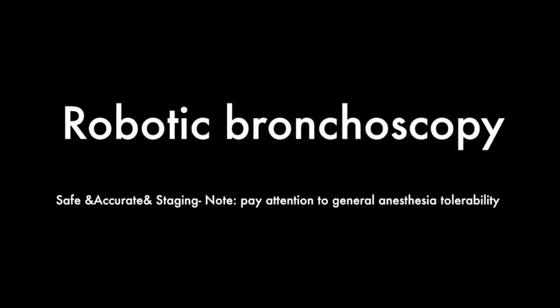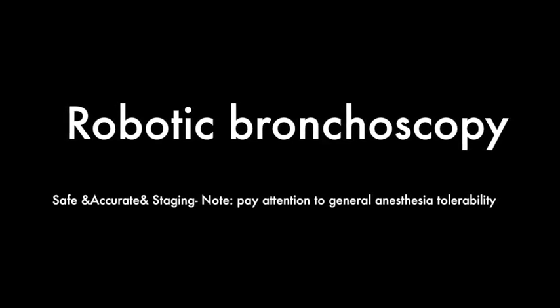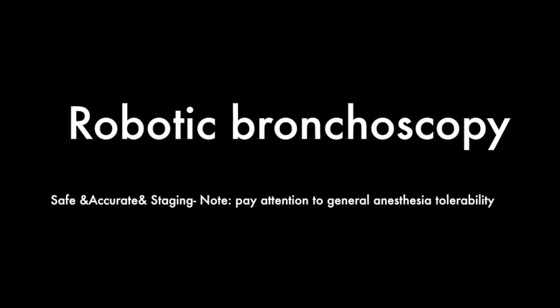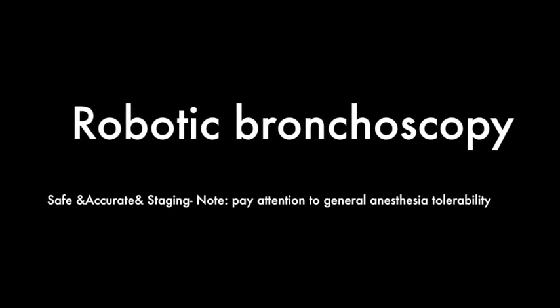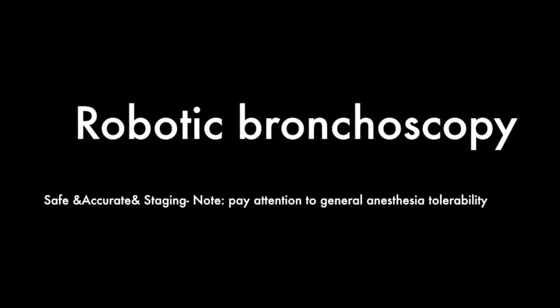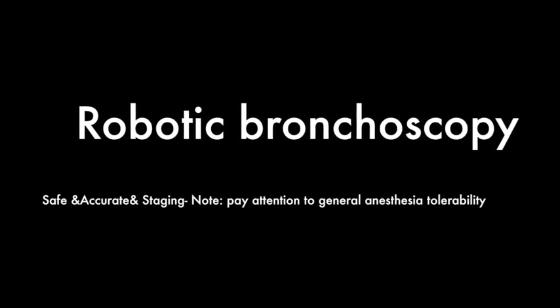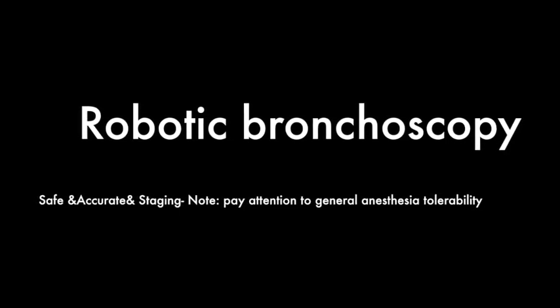So before considering robotic bronchoscopy, we have to take into consideration whether the patient is a surgical candidate, and whether the patient has good cardiac performance in order to tolerate general anesthesia for at least 45 minutes to an hour, and high volume ventilation.